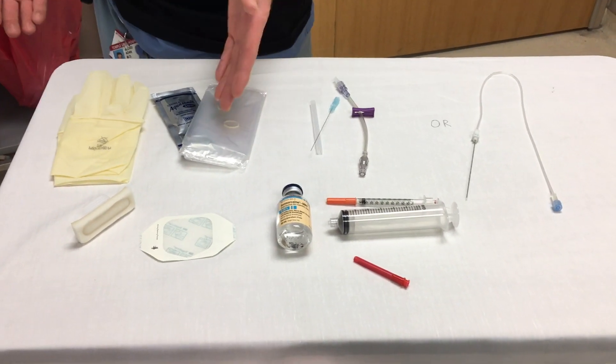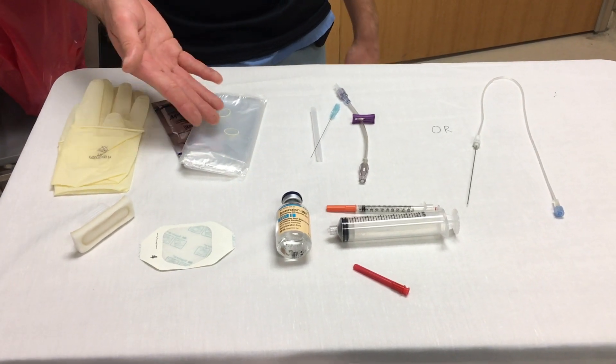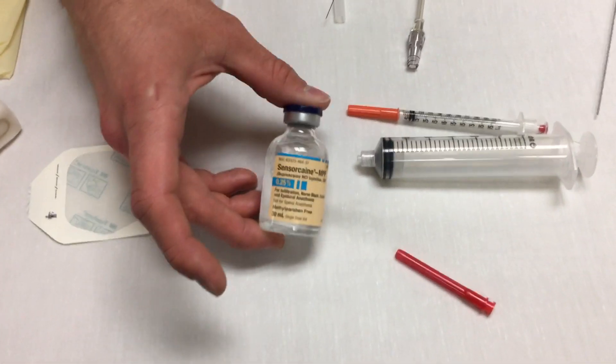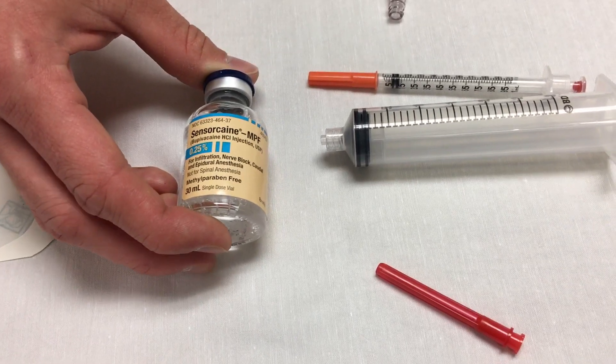You want some sterile gloves, a sterile probe cover, and chlorhexidine. If you don't have the sterile probe cover you can also use a tegaderm. The second step is you want to have some bupivacaine, ideally 0.25%. If you only have 0.5% you can dilute it with some normal saline.